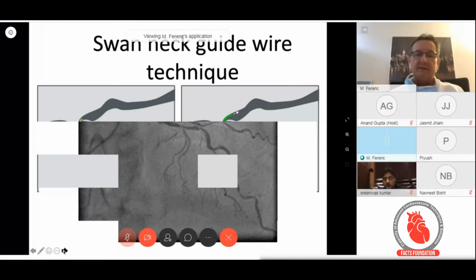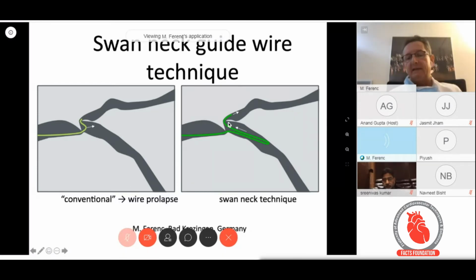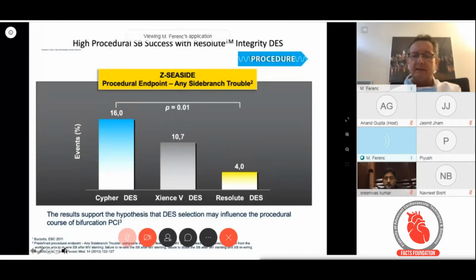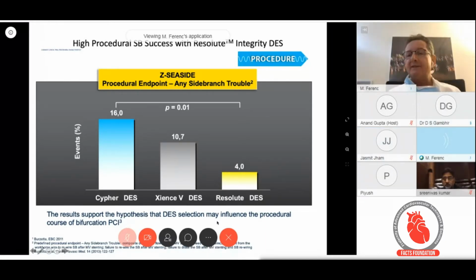This is now for a diagonal branch, but sometimes you have a very similar option for left main. You can go right, and finally you can go with culotte stenting. You can manage even such difficult anatomies. So it's important to have a good stent even with optimal side branch access. Okay, thank you so much.